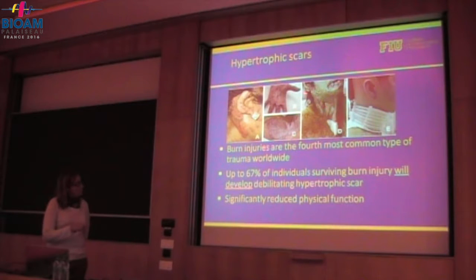You can see how the ultrastructure of the skin, from being a nice ordered mesh with great elasticity, has now become much more rigid and shows this particular orientation. For example, here, this is a big bundle that limits the function of this individual to move his neck.